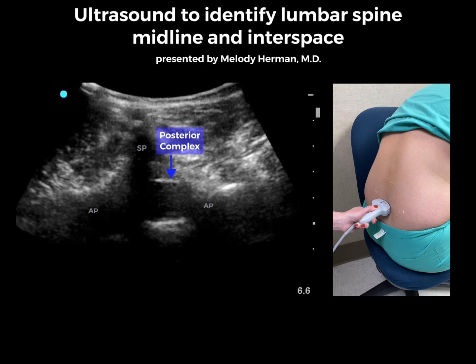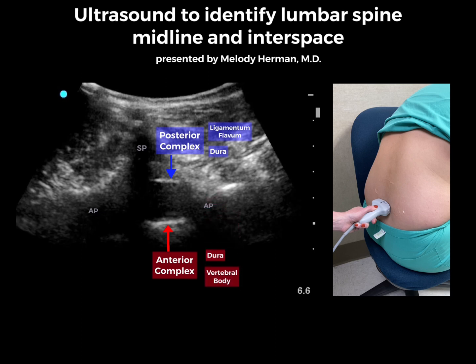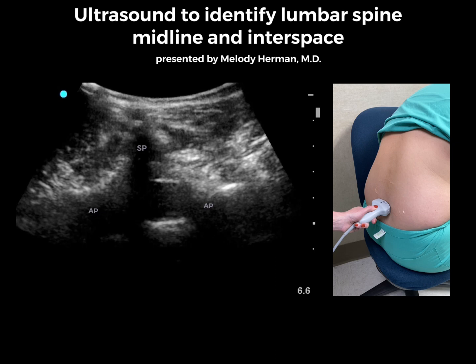Here we see the posterior complex, which comprises the ligamentum flavum and dura, the anterior complex, which is made up of the dura and vertebral body, and the intrathecal space in between. From this image, we've identified midline and the depth to the epidural and intrathecal spaces.